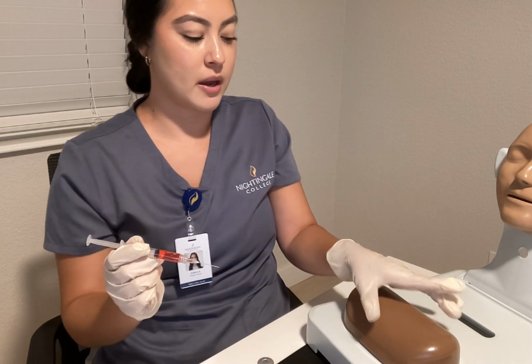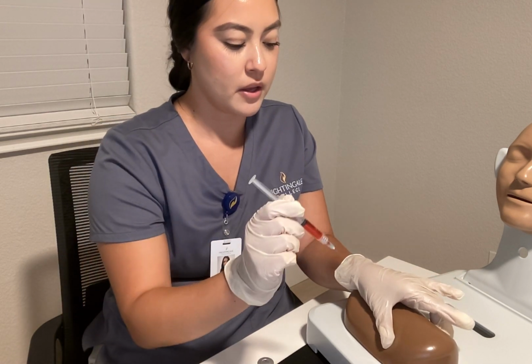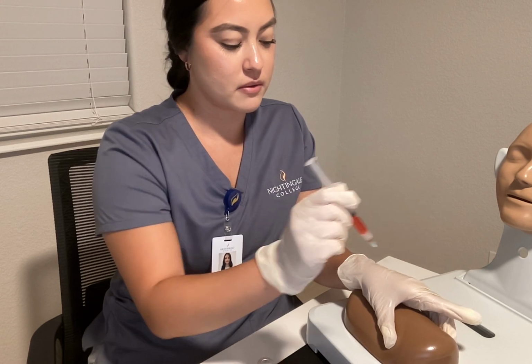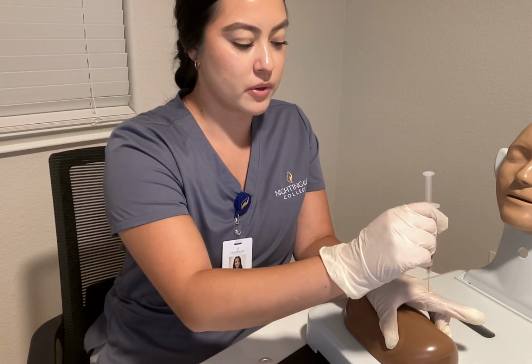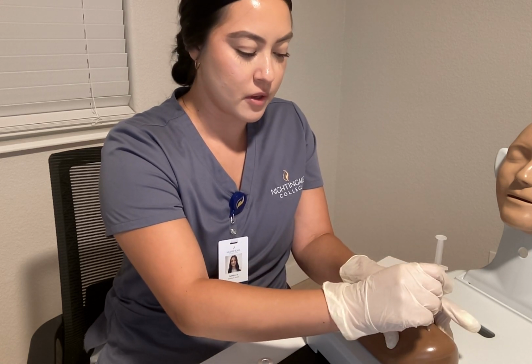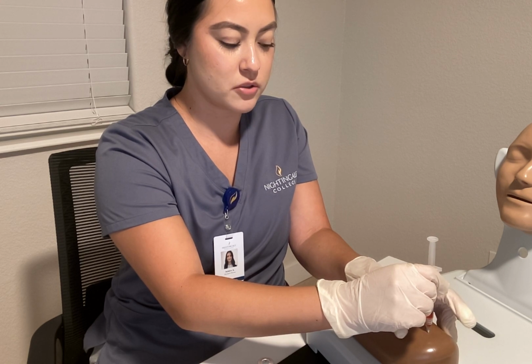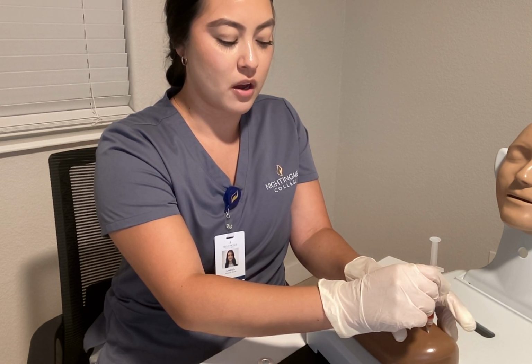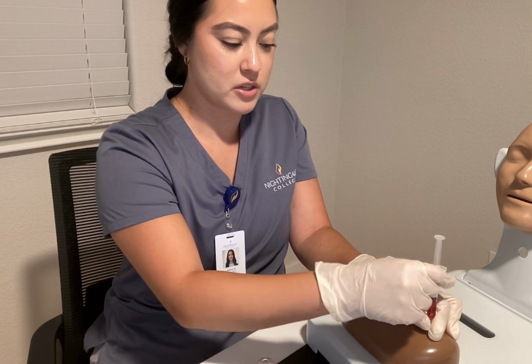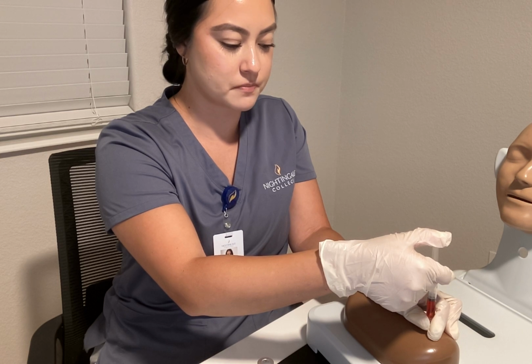Once that's drying, we are now going to inject, so I'm going to remove the cap. We'll throw that away. I'm going to grab the muscle and create it here, make sure that I have the correct placement, and we're going to inject at a 90-degree angle. Once we inject, I'm going to take my 2 fingers on my non-dominant hand just to stabilize the syringe, and with my dominant hand I'm going to inject the medication.